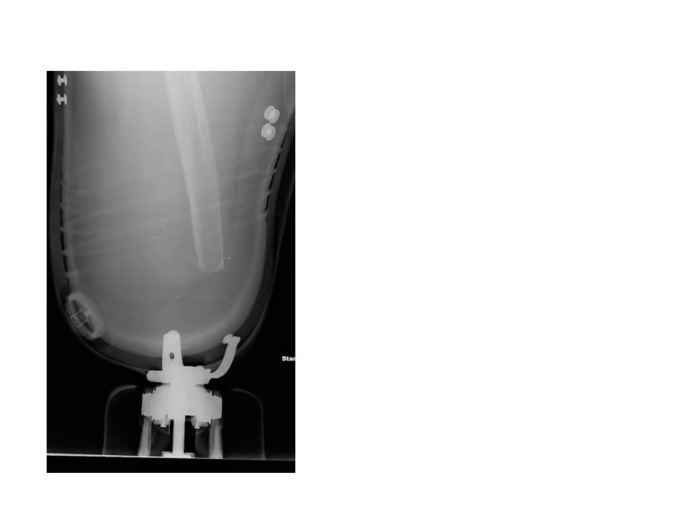Let's look at this case example of Gail, who has been an above-knee amputee for some time. You can see her residual short femur sits in the socket. It's not particularly well controlled and is not even properly aligned with the prosthetic leg.